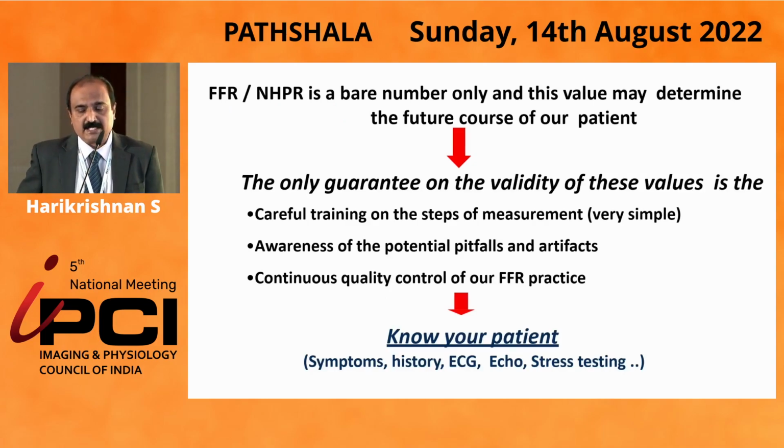So to conclude, ladies and gentlemen, the FFR or a non-hyperemic pressure ratio is just a bare number, and this value may determine the future course of your patient. But the only guarantee on the validity of these values is the careful training on the steps of measurement, which is very simple, awareness of the potential pitfalls and artifacts which I have mentioned, continuous quality control of your FFR practice, and the most important is know your patient.